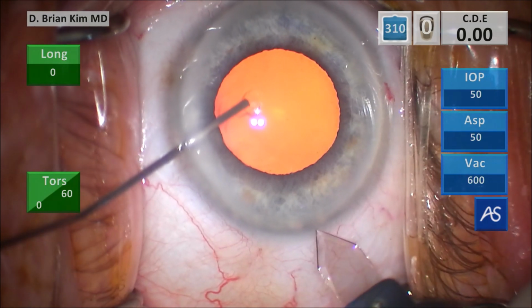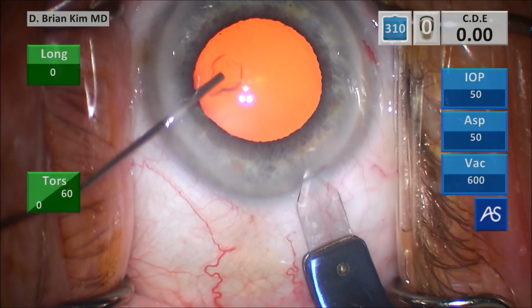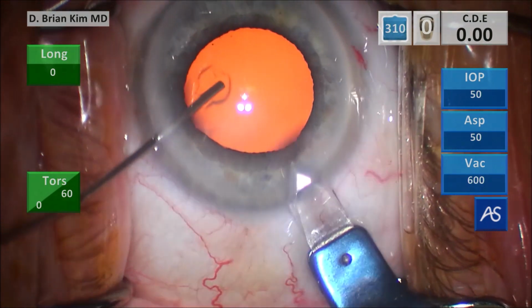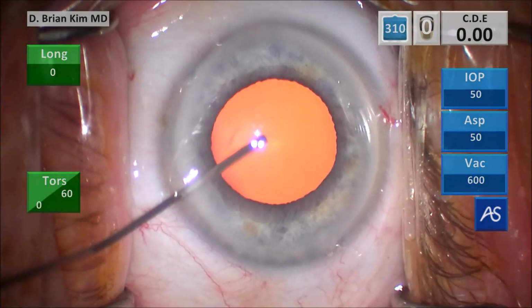And this is a triplanar corneal incision. I make a vertical groove, place the blade into the deep part of the groove, turn the eye towards me, and then I enter. Push some more viscoelastic at the end there.